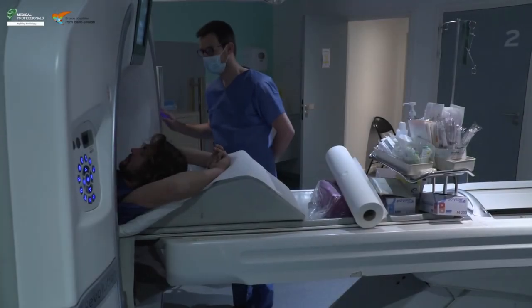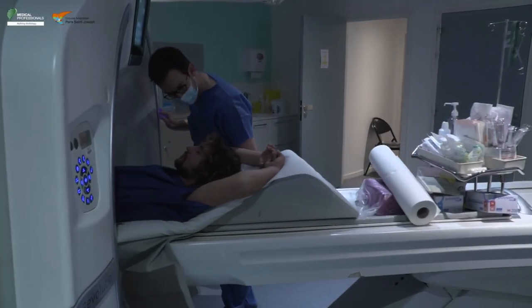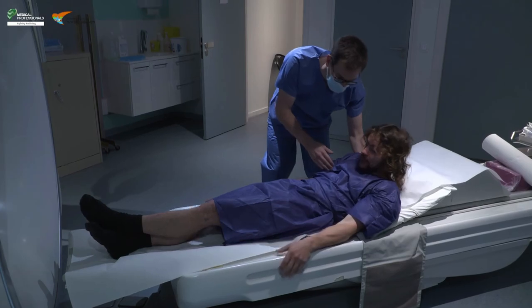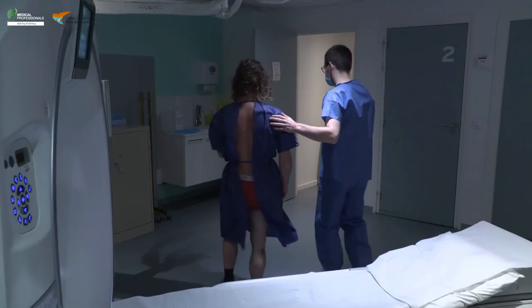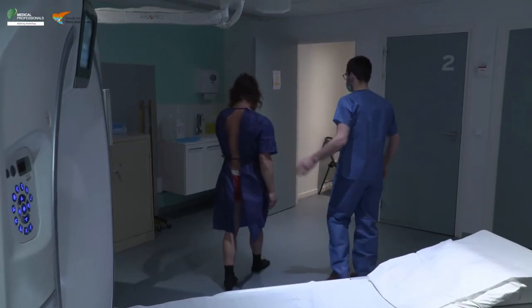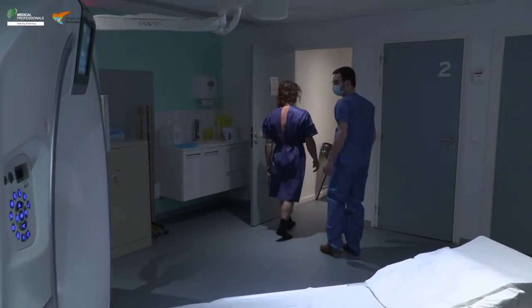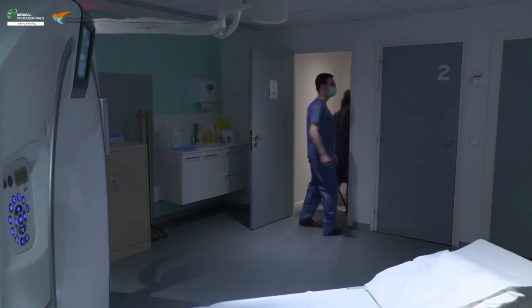At the end of the examination, accompany the patient back to the changing room and tell them they can get dressed. Provide the patient with any post-exam instructions or department protocol.